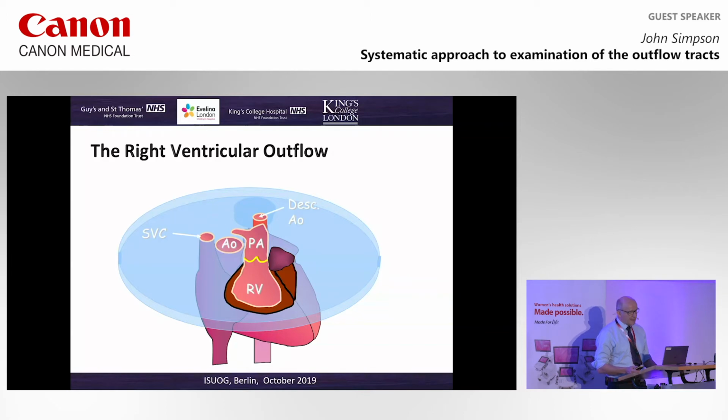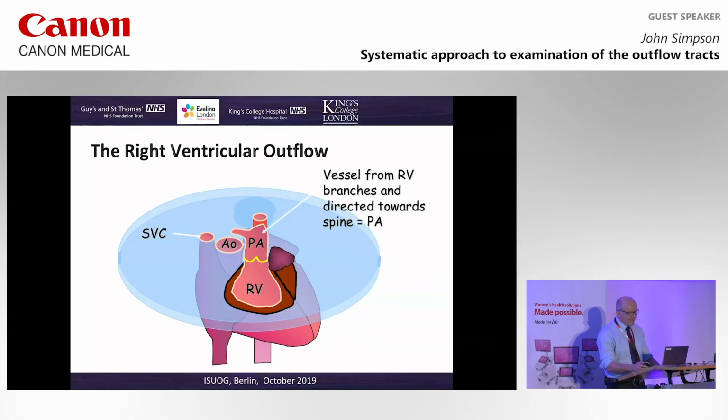And the pattern you're looking for is this lining up of vessels from the SVC to the aorta and the pulmonary artery in ascending order of size, and usually with the pulmonary artery very slightly larger than the aorta, but not a marked difference. And that's simply confirming what I've said. The AP orientation, the early branching, and pretty similar size of the aorta and pulmonary artery.